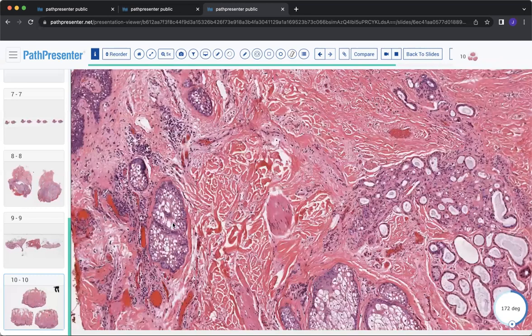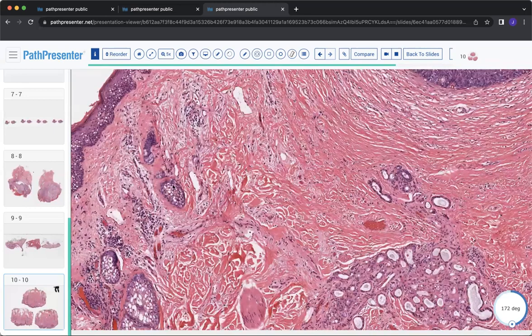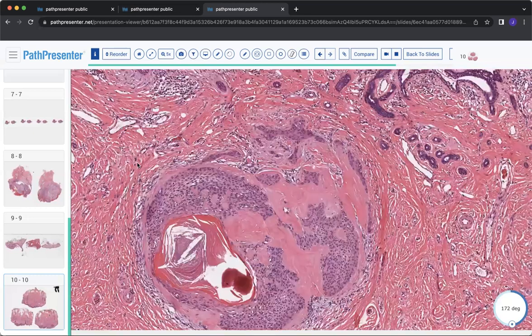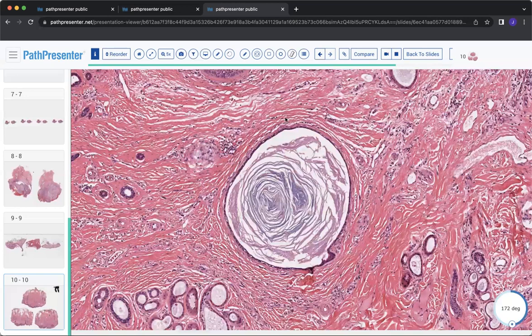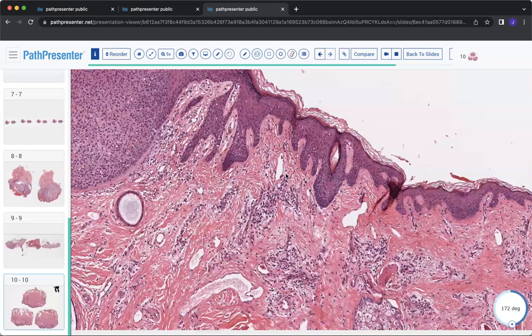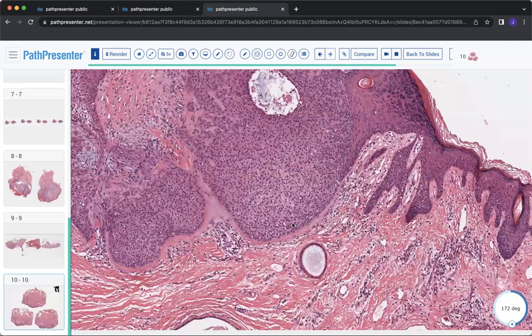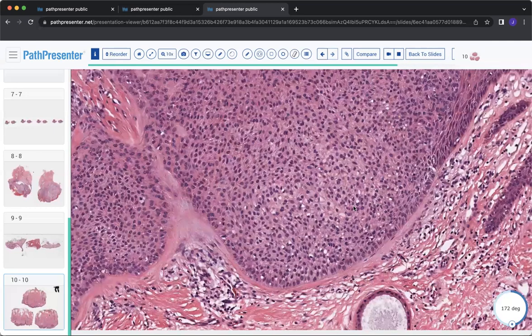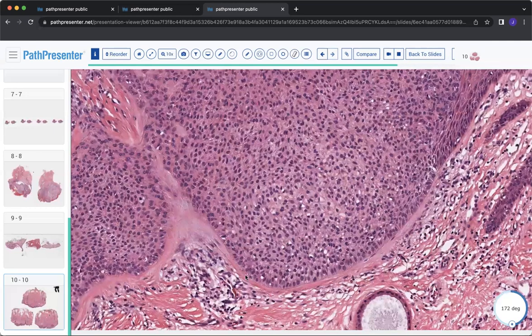You also have some areas of sebaceous lobules that don't seem to be associated with any follicle. And there's some other things I just skipped over, and I'll go back to them. Some more sebaceous glands here. And then looking at the epithelium, you get an area that is coming down, it's projecting downwards, it's got a clear cell population, a very well delineated eosinophilic rim around it.